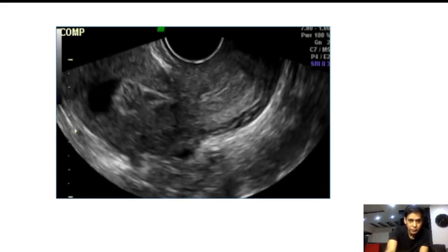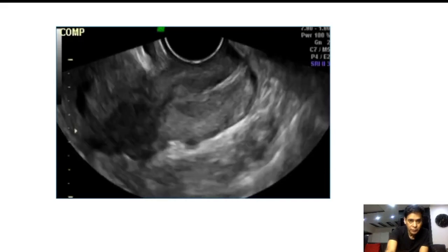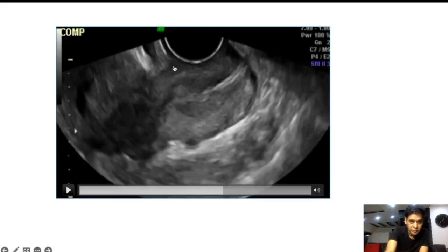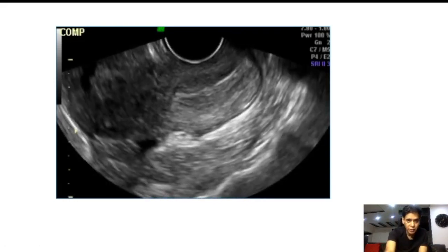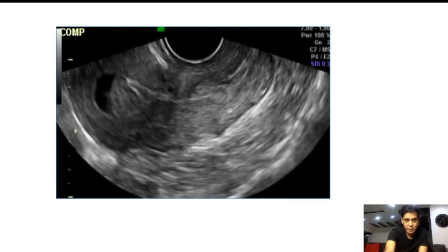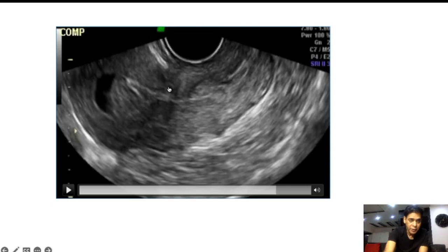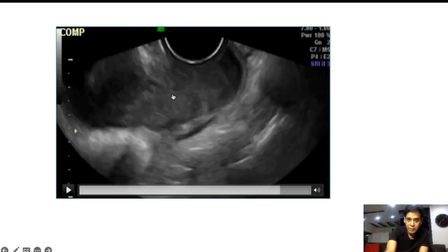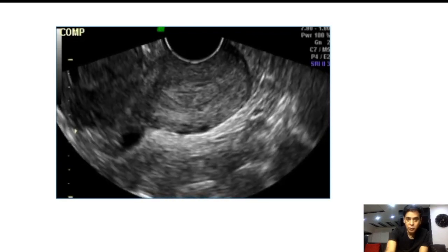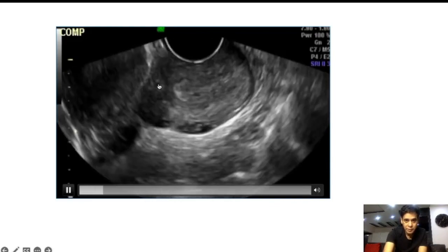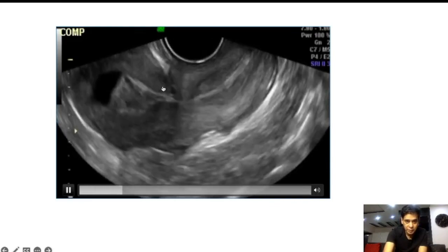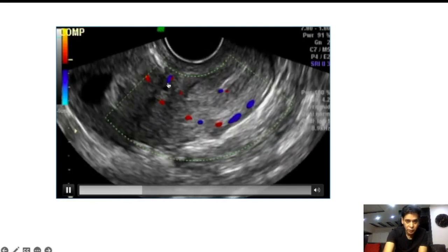Again, you can see here that there is a contraction of the lower uterine segment, and this contraction is because of the proximal area — the cesarean scar defect referred to as uterine niche — and this is the reason for the whole problem. This fluid collection internally, this contraction, and this uterine niche all relate to each other.